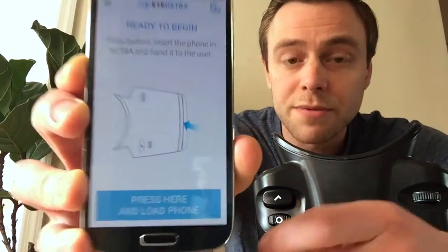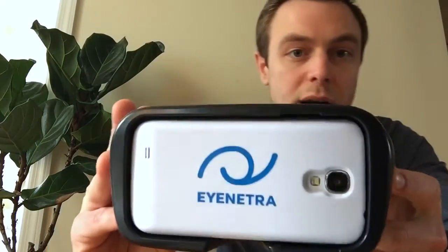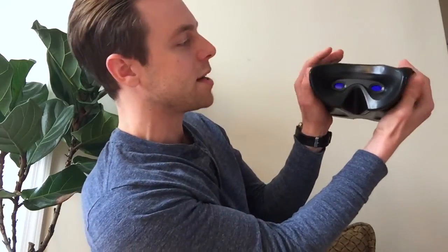The tutorial also shows how to load the phone into the device. I pop it into the autorefractor, making sure iNetra is faced up. To hold the device, I make sure my thumbs are sitting nicely on the pads, and my fingers sit comfortably on the controls. I like to tell people to sit at a table with their elbows propped up so patients are comfortable and the device is stable. While not necessary, we find it helps patients stay relaxed.